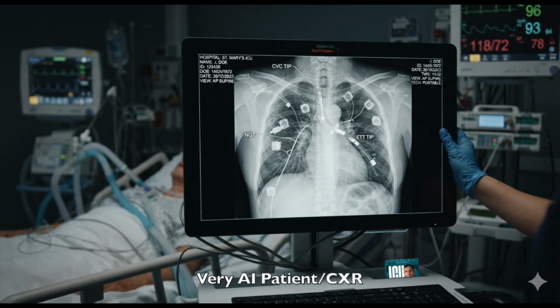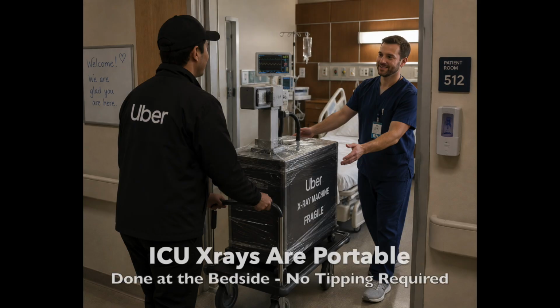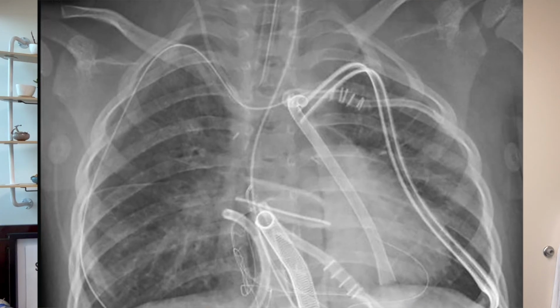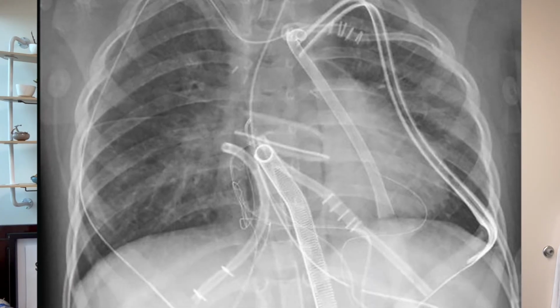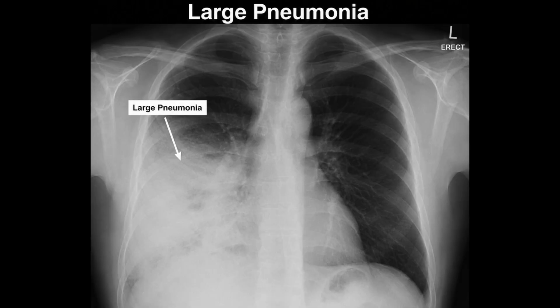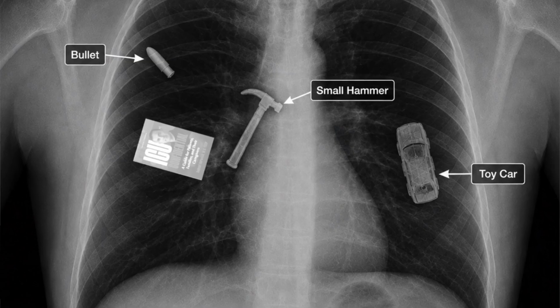Common uses of x-rays in the intensive care unit, for example, include chest x-rays, where we can look at the ribs, the general state of the lungs, the heart, and the upper abdomen. If you're on a ventilator or you just got a special kind of catheter intravenously, x-rays are used to confirm that the tubes and catheters are all in the correct position. They can also be used to identify fluid in the lungs, inflammation like pneumonias, and even foreign objects.